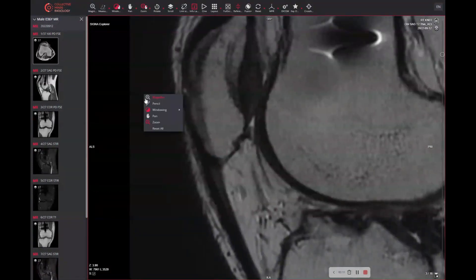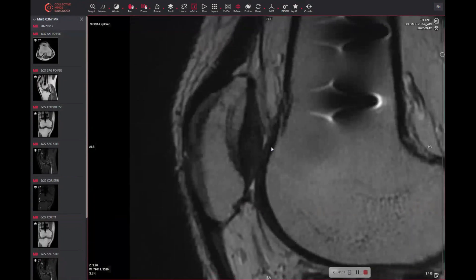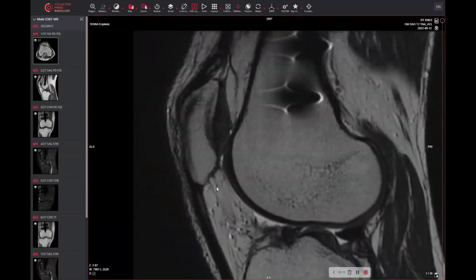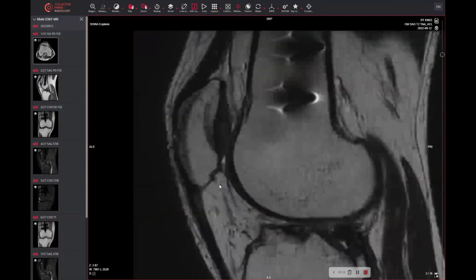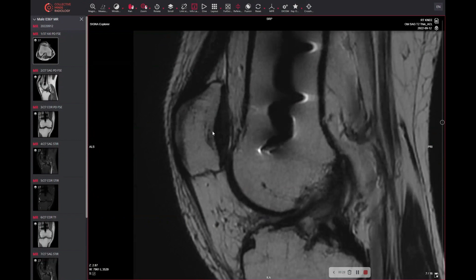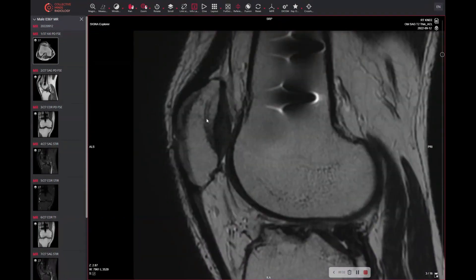Let's zoom in into the patella. When you scroll through here you might or might not appreciate this line here. It's a little bit parallel or even concave to the surface. The underlying cartilage is thick, normal, it's fine. But these lines here could catch your eye.